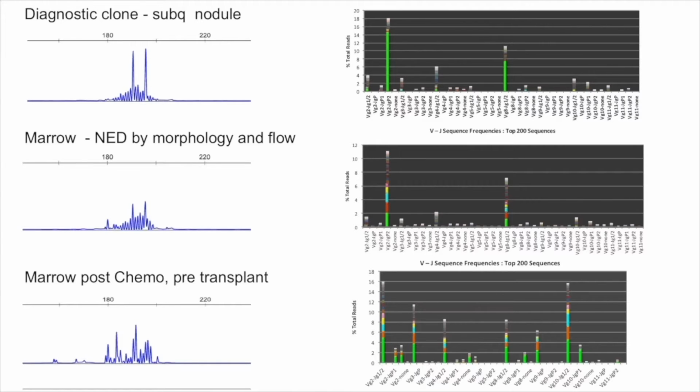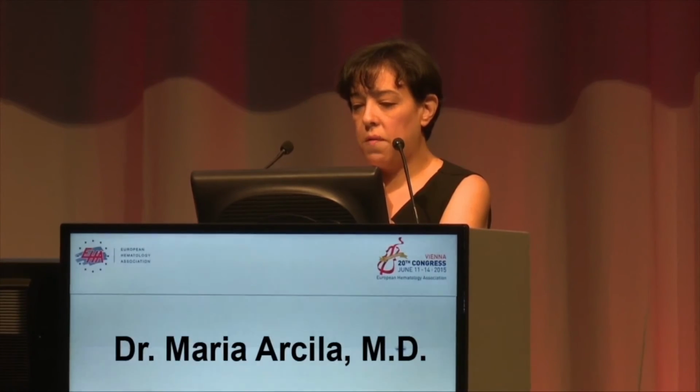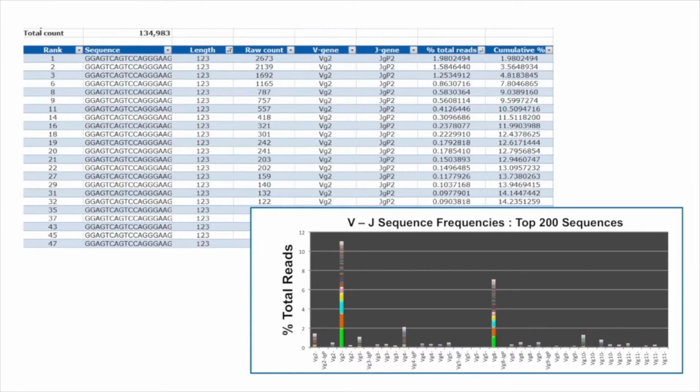see here. And even in this post-chemotherapy pre-transplant, you see a lot of oligoclonality with many prominent clones, I would say. But again, the same exact sequence can be seen much lower than the other ones that you're seeing here, but you can still track it and know that the disease is there. So the study that we did on this patient was to follow several, the 2 clones, and even some of those other clones that you saw post-chemo, just to see what they would do.